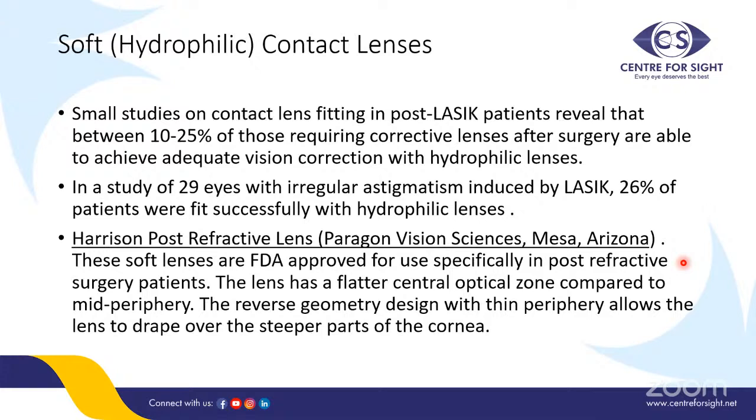So there are various studies that have been conducted post-refractive surgeries with soft contact lenses, and a few studies reveal that almost 10 to 25% of patients requiring corrective lenses were able to achieve adequate vision. And in another study of 29 eyes, almost 26% were successfully fitted with soft hydrophilic lenses.